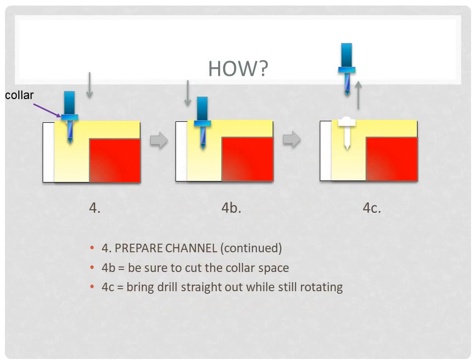In preparing the Max pin channel, be sure to prepare the collar space. When the channel former collar reaches the dentin, you will feel more resistance. Continue with a little pressure until this collar area is prepared in the dentin surface.